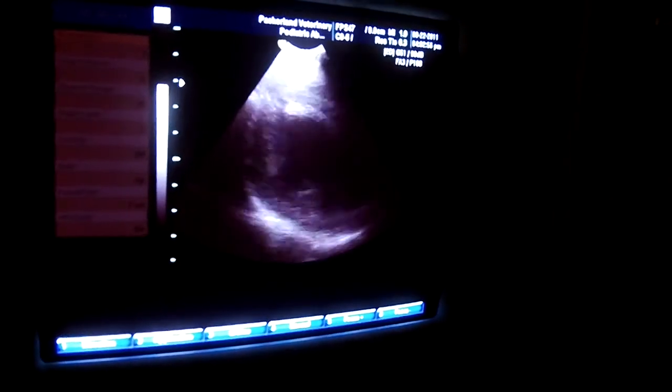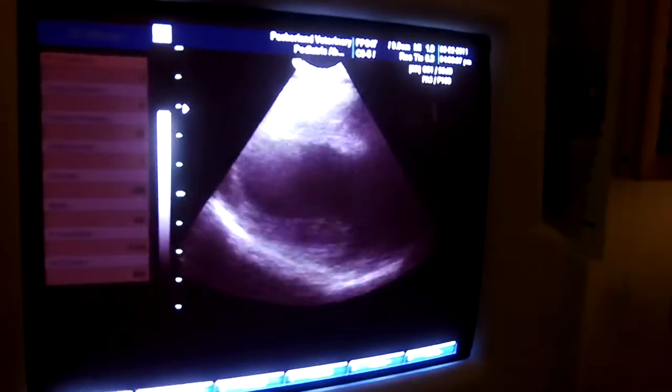What are we looking at, Dr. Mansfield? This is a left ventricle. Look at that from the side. When we get that mushroom picture, we're looking at a cross-sectional left ventricle. Here it is on the longitudinal axis.